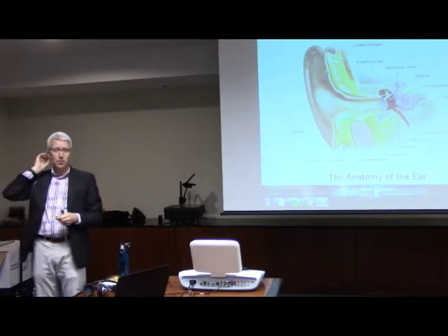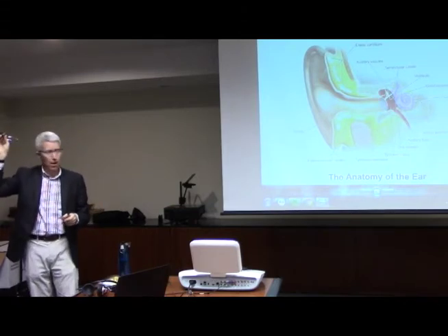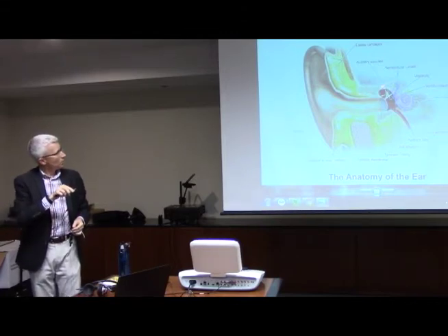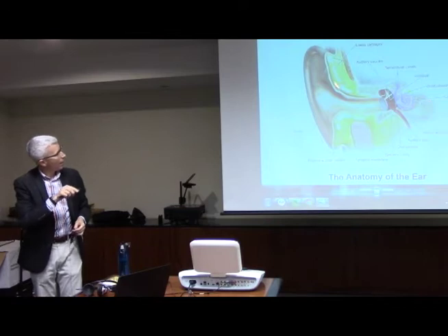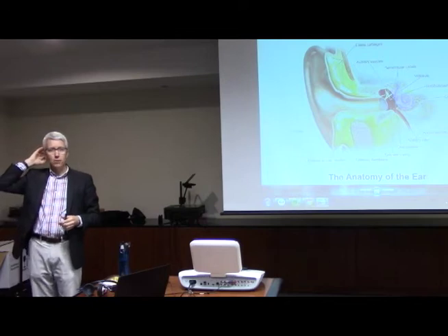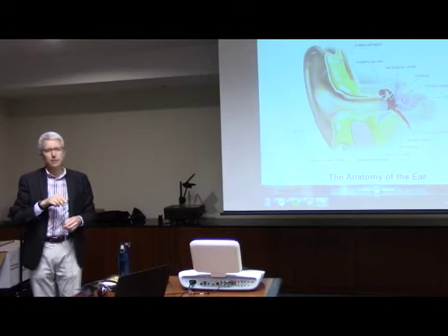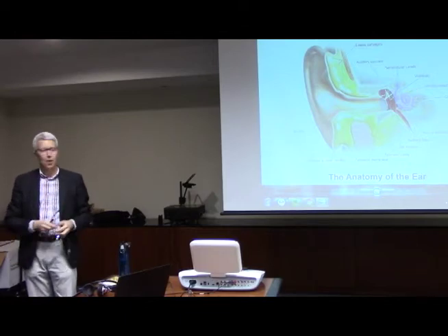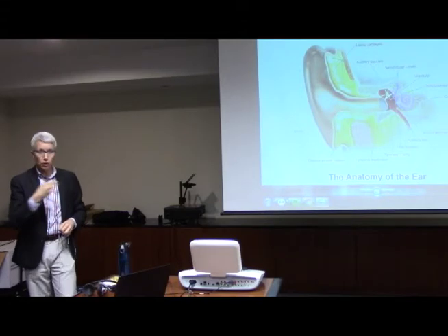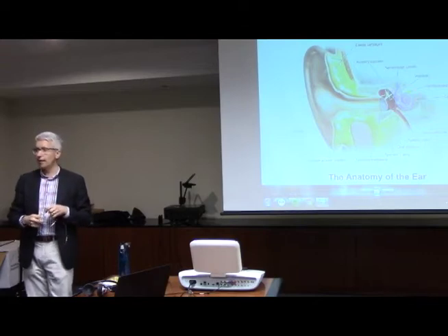It's designed to put a certain amount of pressure on here because what you're doing is this is vibrating. I mean, it's literally a vibrator. And when that does that, this is all bone around here, and there's obviously bone back there that you can't see. It vibrates the bones of the head, and when it vibrates the bones of the head, it basically sloshes around the fluid in the inner ear. So I had said, normally the way we hear, sound goes through here, and then this little plunger moves the fluid in the inner ear. Or you can vibrate the bone directly and it moves the fluid in the same way.